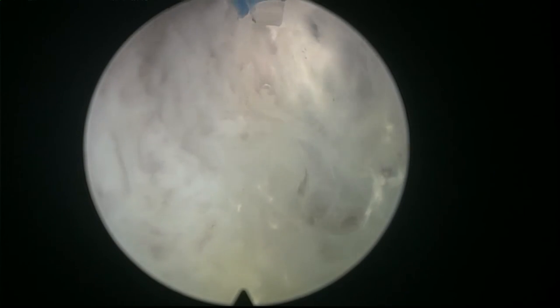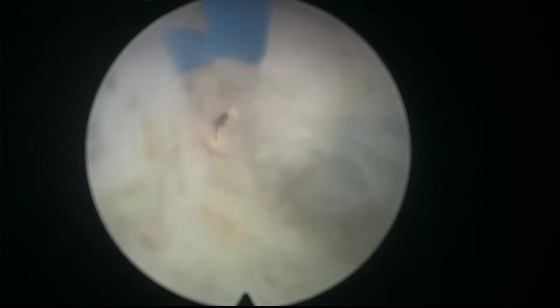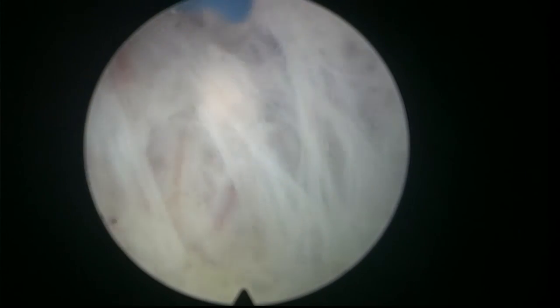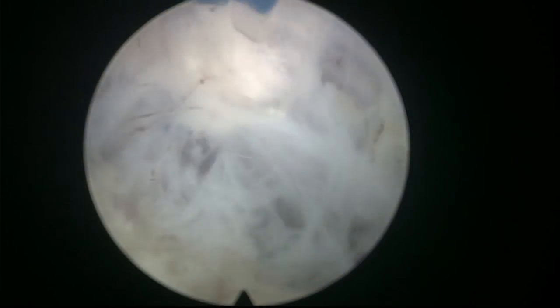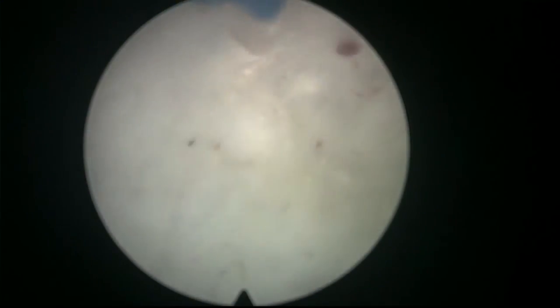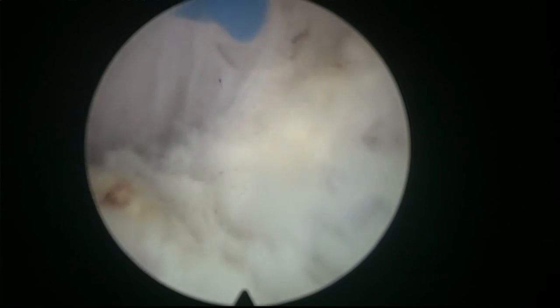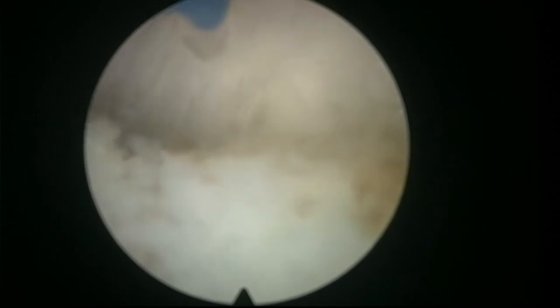You want to go around the adenoma several times to make sure the depth of the dissection is symmetric — an asymmetric dissection gets more difficult. When we go anteriorly, we have to point toward the midline and center of the bladder neck. The angle is changing, so you cannot continue firing against the line of attack — you have to fire closer to the adenoma. The scope is tilting a little, pushing down the adenoma so we can get down toward the bladder neck. It's a very nice plane with good visibility and not much bleeding.